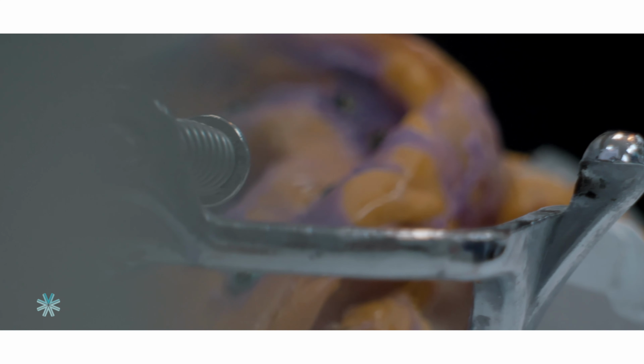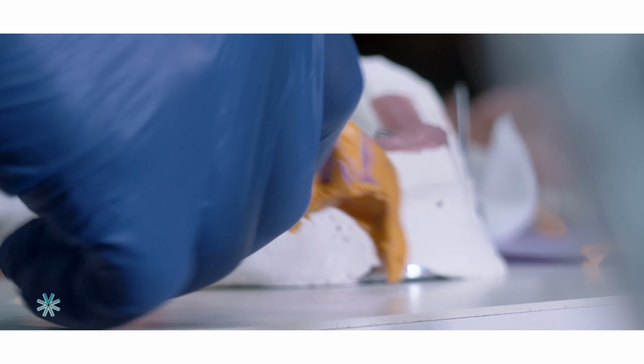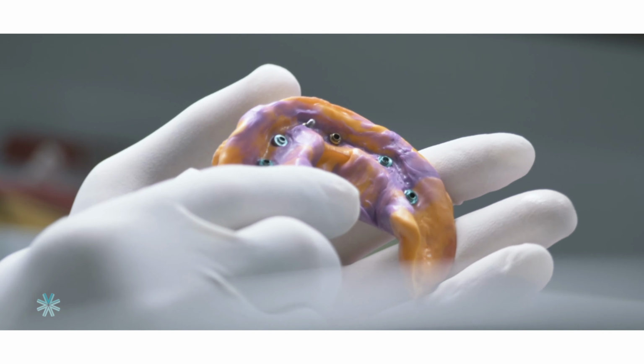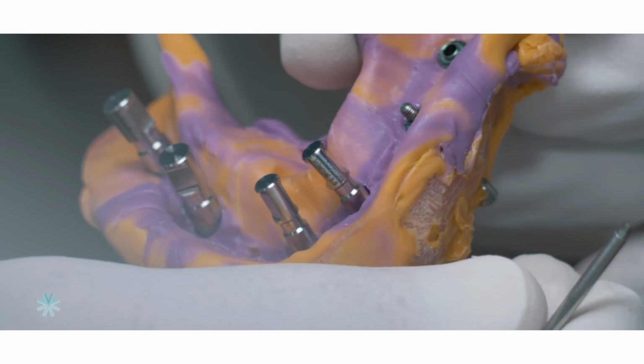Once we receive that impression from a doctor's office, we'll take a lab analog, which effectively is an implant replica. Its job is to replicate the actual implant that's in the patient's mouth. So each implant system will have different platform sizes. We have to match up that impression coping with the proper analog that fits it, right? So we'll take the impression coping and we'll screw it into this lab analog. Then we'll place it back into the PVS impression, the impression coping, if it's a closed tray style technique.